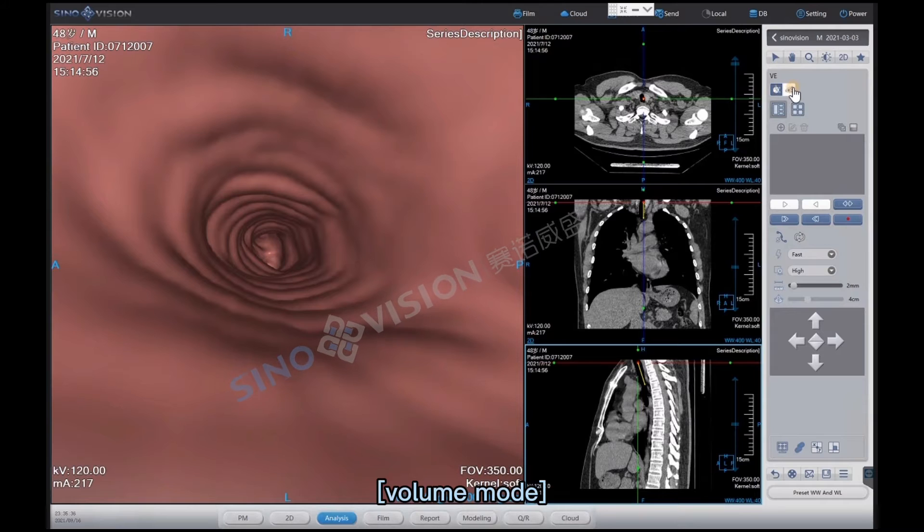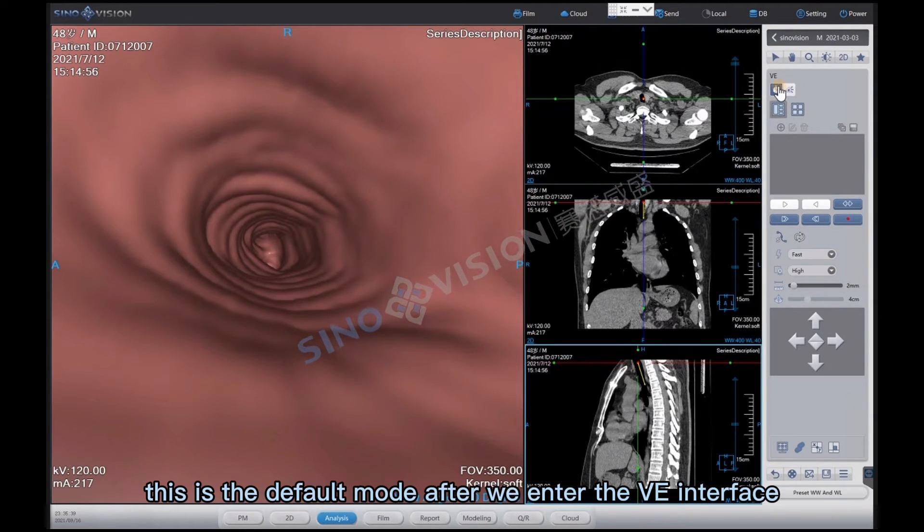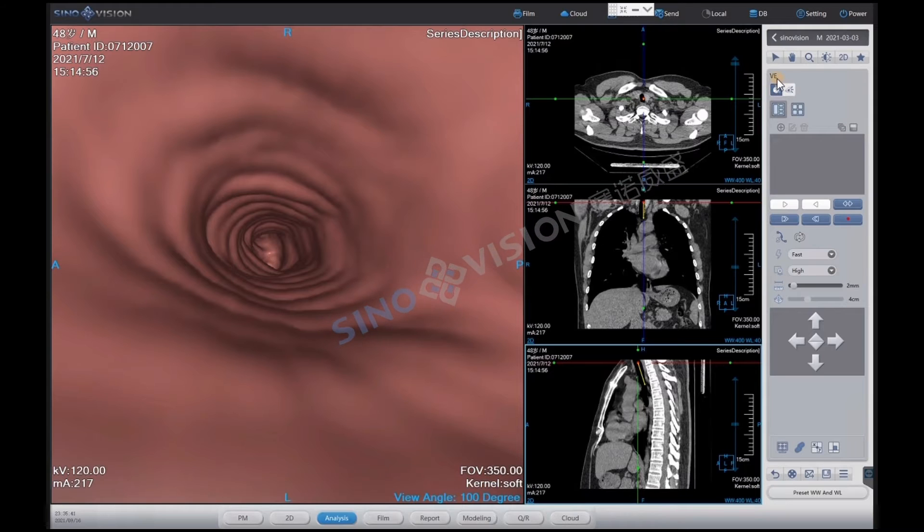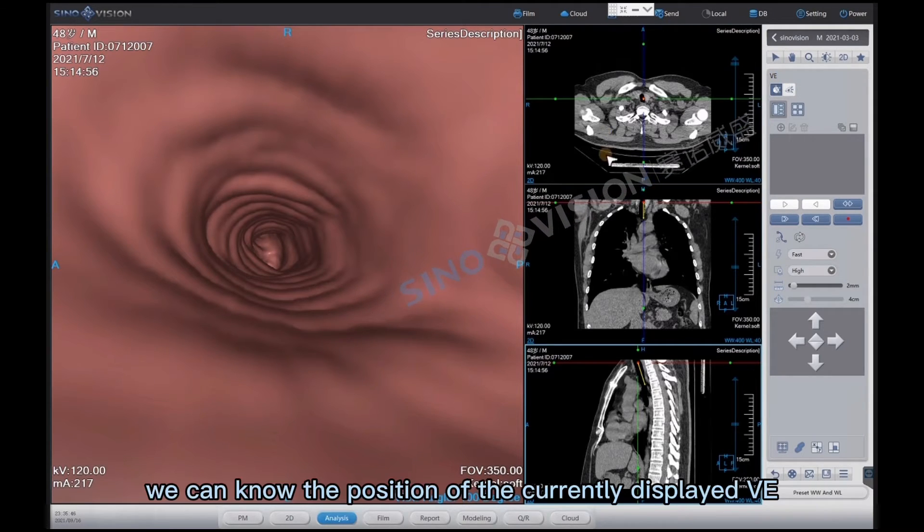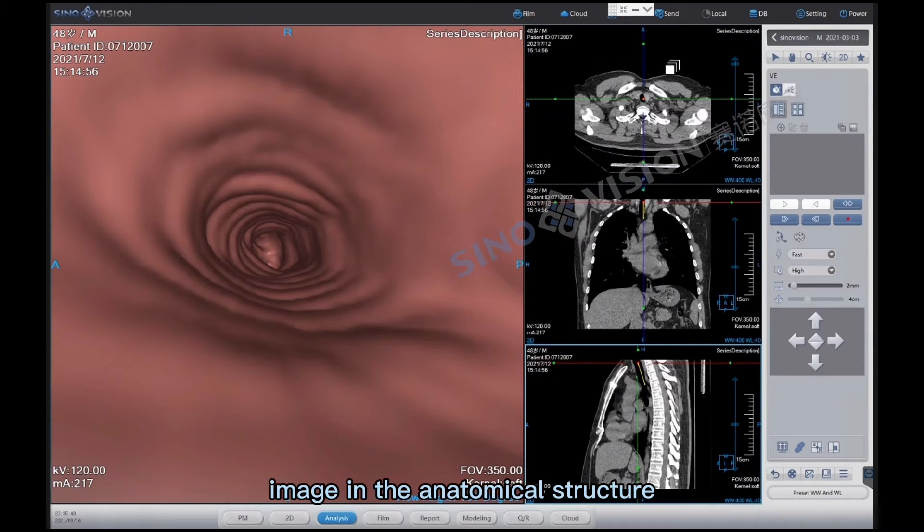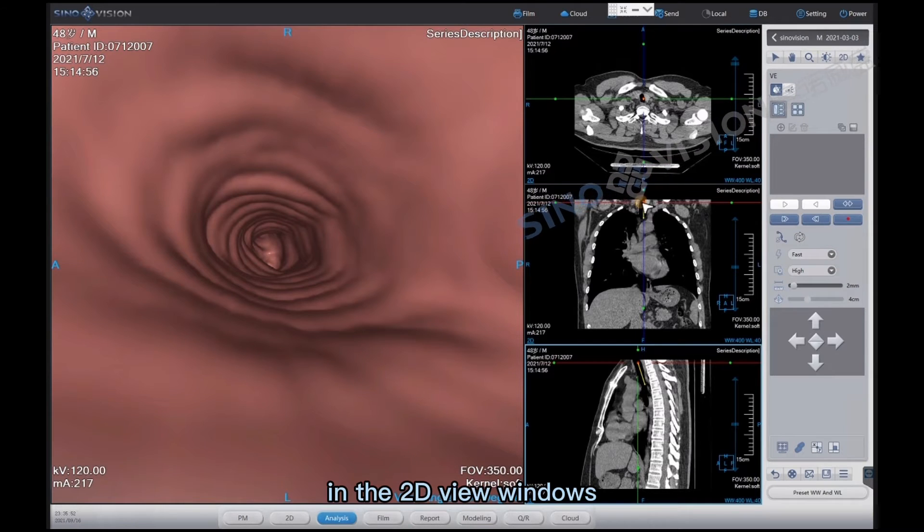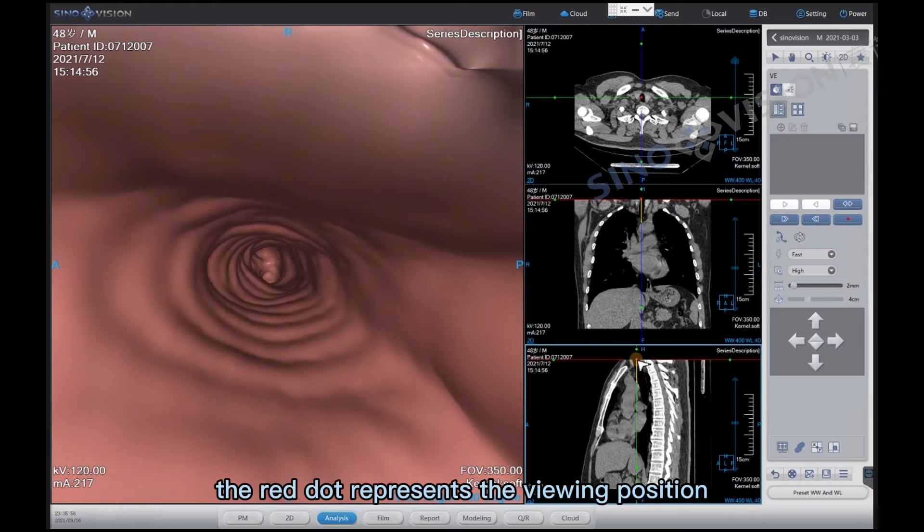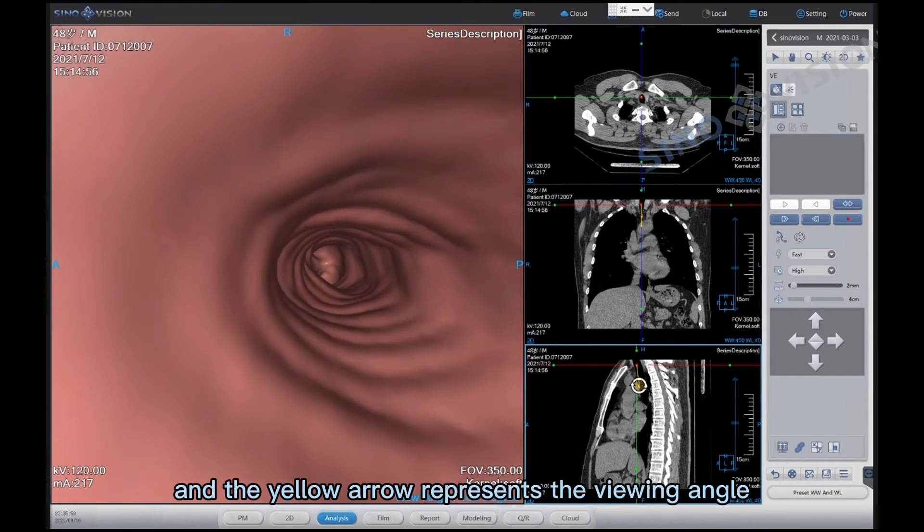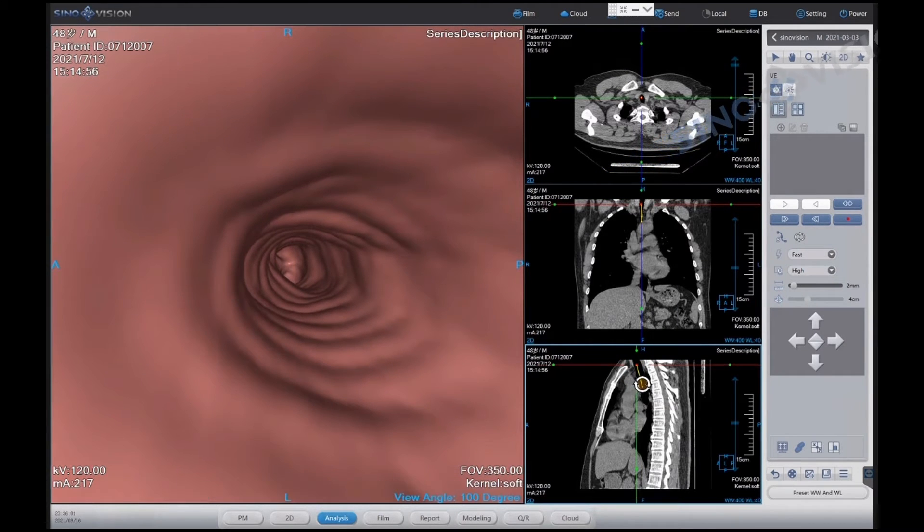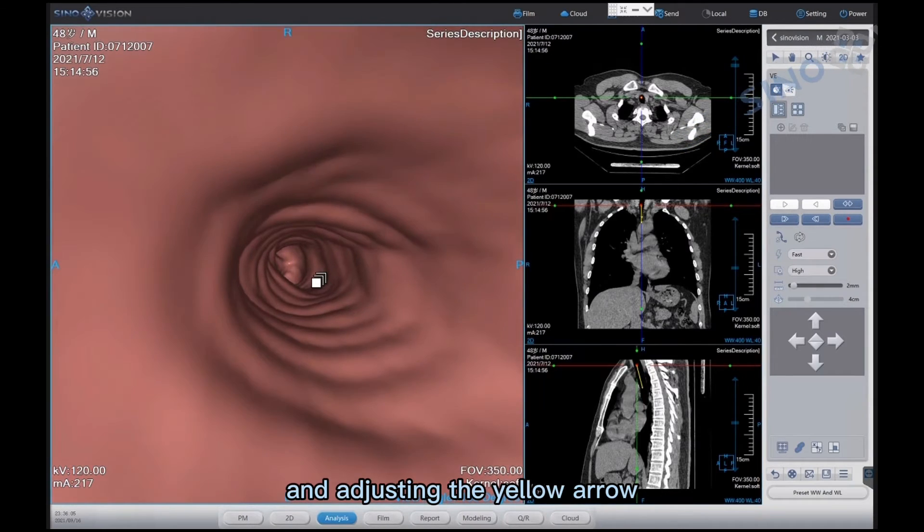Volume mode. This is the default mode after we enter the VE interface. In this mode we can know the position of the currently displayed VE image in the anatomical structure. In the 2D view windows, the red dot represents the viewing position and the yellow arrow represents the viewing angle. After locating the red dot and adjusting the yellow arrow.